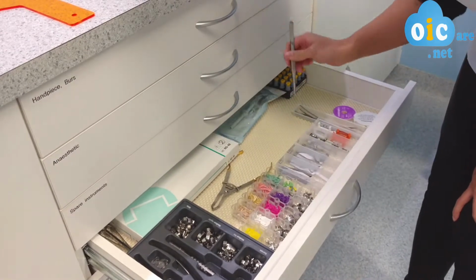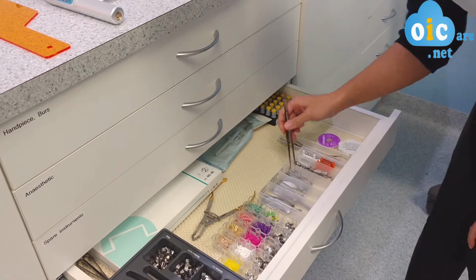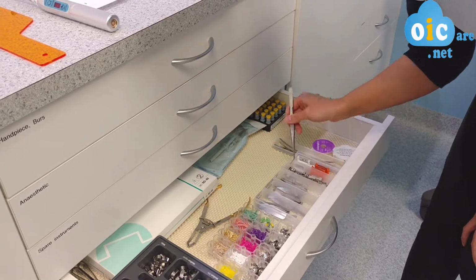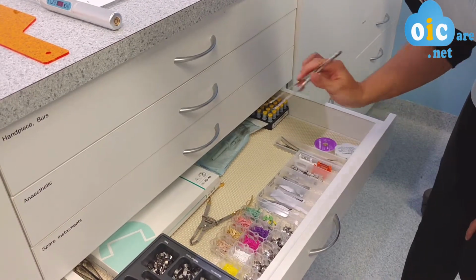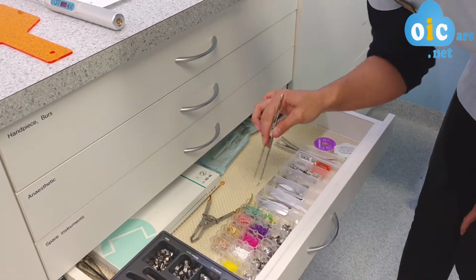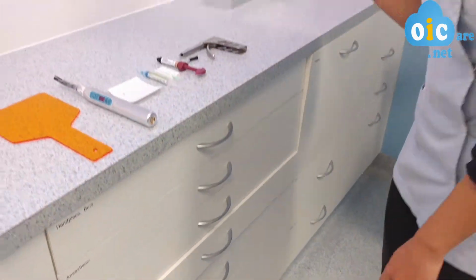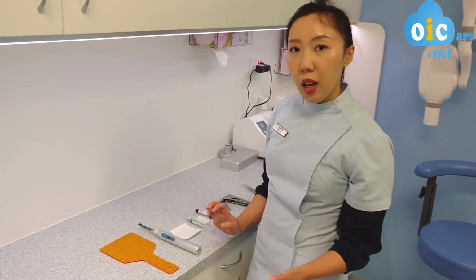We also have matrices like this. This is called a tofflemire. This is the holder, and this is the band. We put this band inside this holder, and then we put it on your tooth. After the filling is finished, we remove all of these so nothing stays in your mouth or in your teeth.